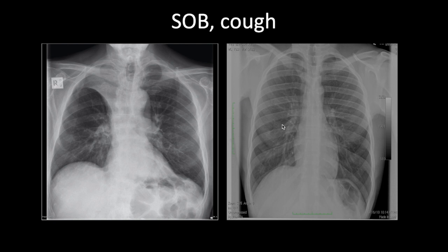In this example, comparing to the normal film, you can see loss of air in the upper zone on this side. The trachea is pulled slightly to the right side, and the right hemidiaphragm is slightly elevated. The right hemithorax in general just looks much smaller than the left — so there is volume loss on this side. This is right upper lobe collapse. The right upper lobe collapses in a superior and paramedian fashion.